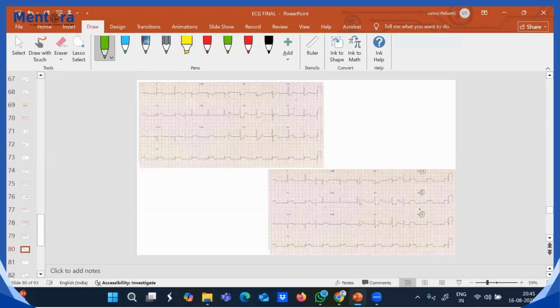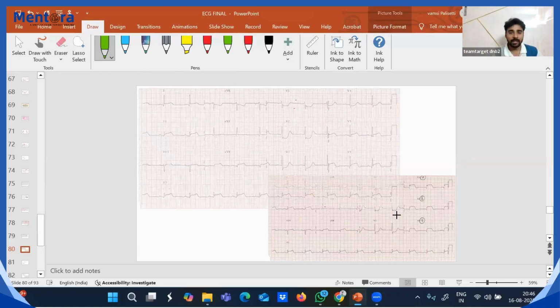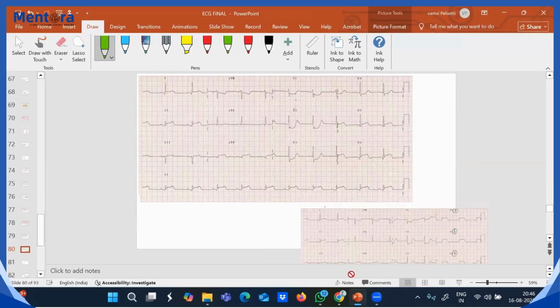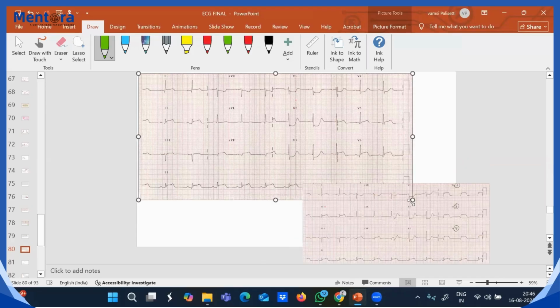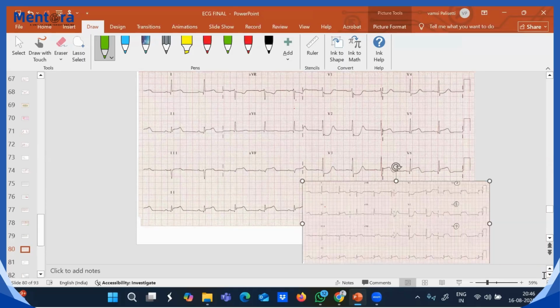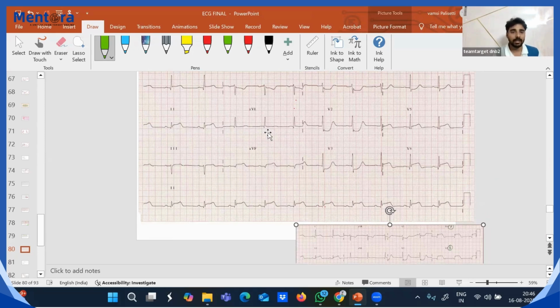Okay. Thank you. Just to go with this, identify the ECG. If you're identifying, very happy. Inferior wall MI, lateral and inferior both are there. Posterior inferior.